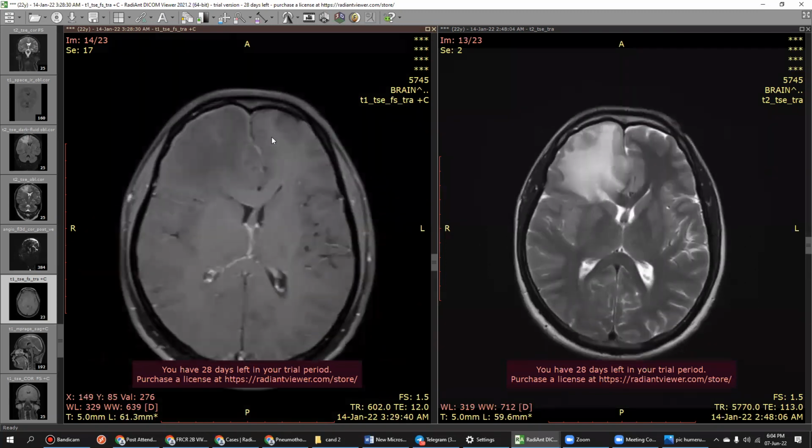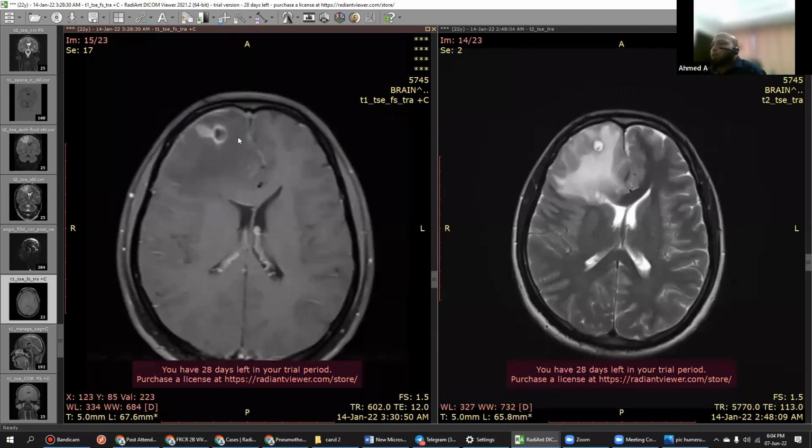Okay. This is the colloidal stage when the larva is dead and the membrane is leaky and the fluid leaks. Then it causes a lot of edema and all. In the vesicular stage, there will be no edema. Okay.